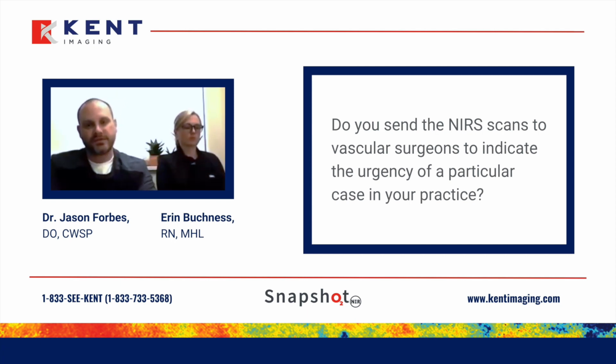Yes, and that's one of our major uses for it, and one of the major selling points. Instead of calling a vascular surgeon and saying, I might feel a pulse, but it's pretty weak, and the cap refill is a little bit delayed, and they've got all these other comorbidities, and I'm concerned about them. Well, they get that same phone call probably 20 times a day from primary care offices and from inpatient hospitals where patients were admitted for congestive heart failure, and they're just concerned. Well, this is more than concern. With this picture, I have objective data to say, this isn't somebody that I need you to work up or screen. This is a patient that I've already done that for, and I can tell you right now they need an intervention.